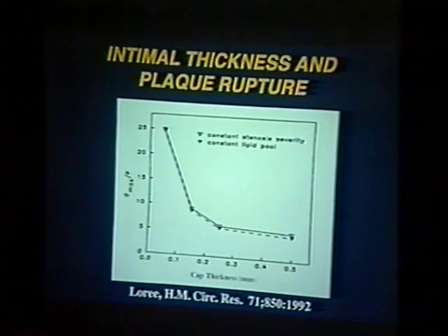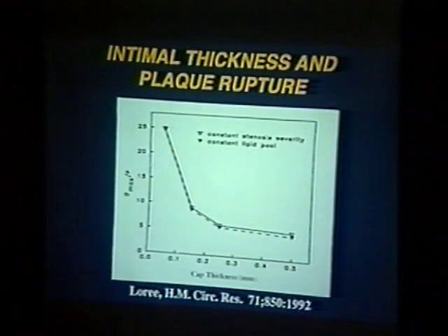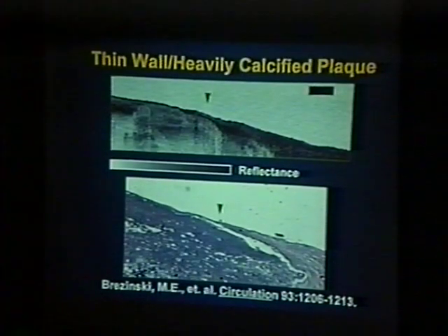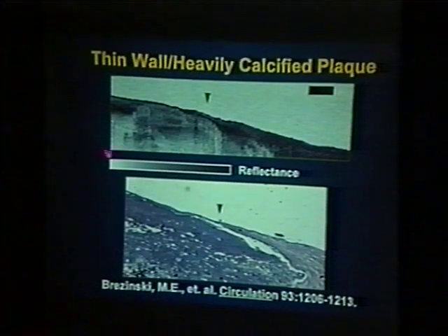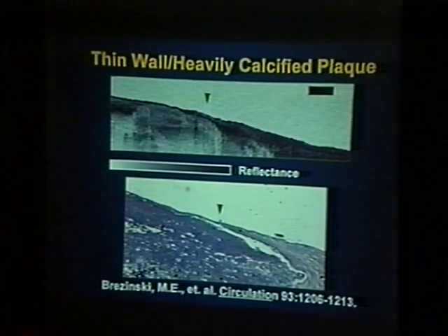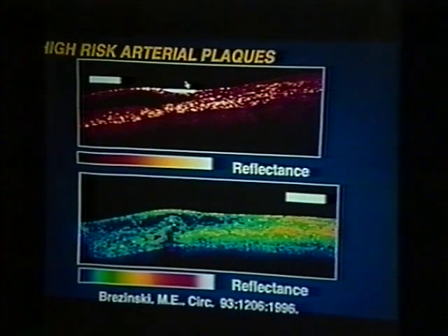Most heart attacks are caused by the rupture of small, thin-walled plaques in the arteries of the heart, which cannot be detected by any currently available imaging technology. These plaques represent less than 20% of the lumen. They release fat into the bloodstream, a clot forms, and the vessel occludes. Therefore, a true clinical need exists for an imaging technology capable of identifying the plaques which cause most of the heart attacks. In addition, when we think of interventional procedures like angioplasty and stenting, these are really microsurgical procedures being guided by the macroscopic imaging technology, fluoroscopy.